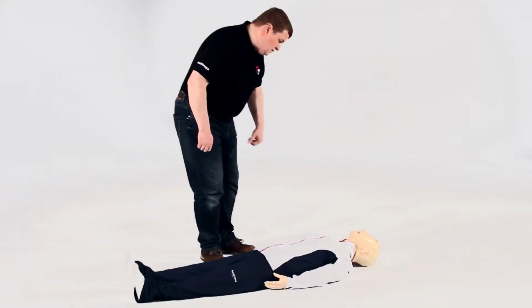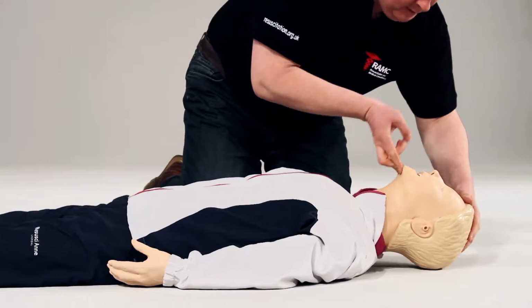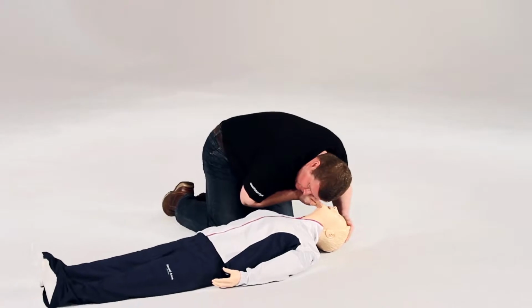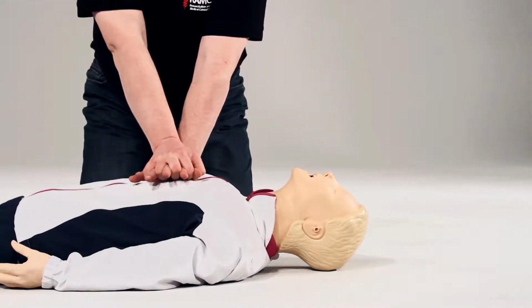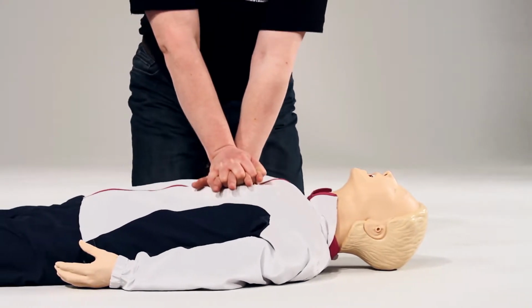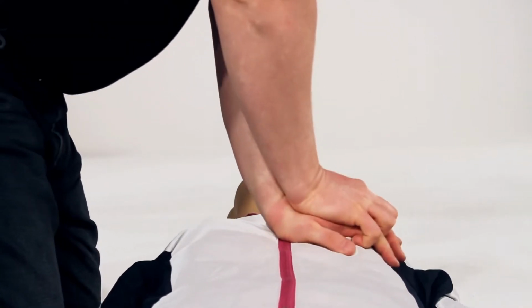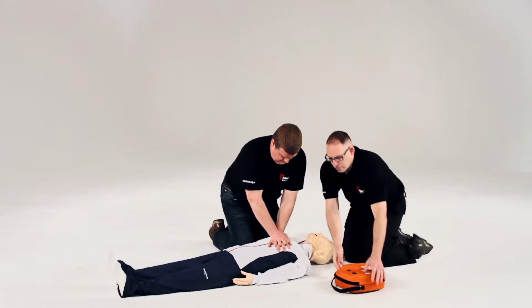Can you hear me? Are you all right? Open your eyes. Can I have some help, please? How can I help? Can you call the ambulance and bring the AED back? Okay. You carry on, I'll work around you.